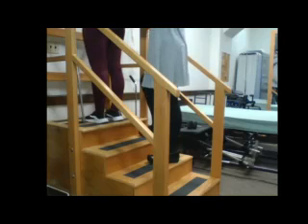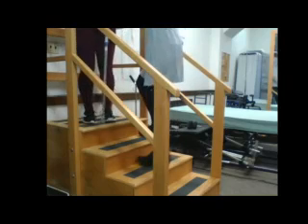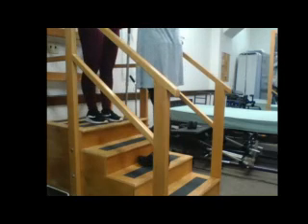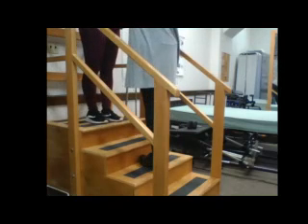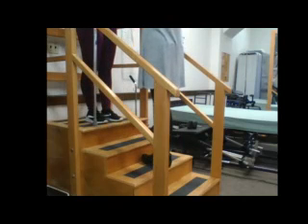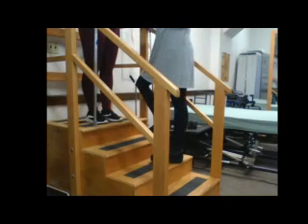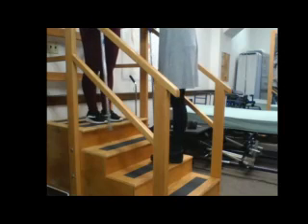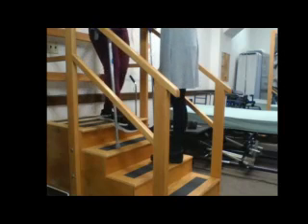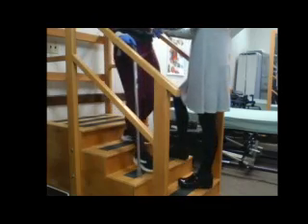All right, now go ahead and slowly turn around. Now, if she only has a handrail on this side, if you notice as she turned, I didn't let go of her gait belt. But if she only has a handrail on this side, you're going to move this over to this hand because that handrail doesn't move. As my patient is coming down, I'm going to stay in front of them, lower, holding onto their gait belt. Okay, bring your cane down. Good job. Cane, backwards.